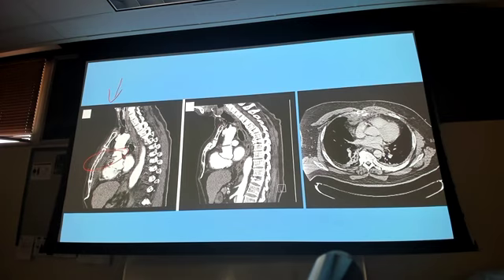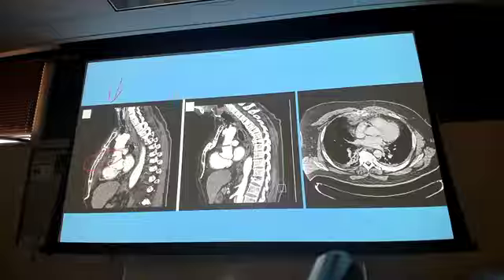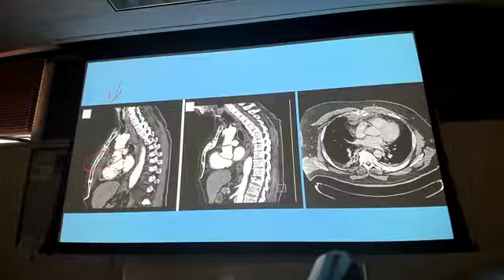Now, am I ordering a CT just to find this? Probably not, because I'm not going to do anything for this. It's only fractured on one side of the sternum. There's no displacement. There's really nothing major to go with. So I'm not going to look at CT just to try to evaluate for that. The odds are they're evaluating for something else, and this was an incidental finding. Maybe the patient had been having weeks and weeks of chest pain, and they couldn't figure out what's going on, so they get the CT with contrast, and then they see that fracture in the sternum, like, oh, maybe this is causing your pain, since maybe it's right here and that's what's going on.